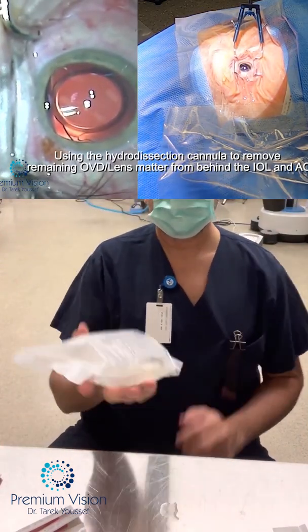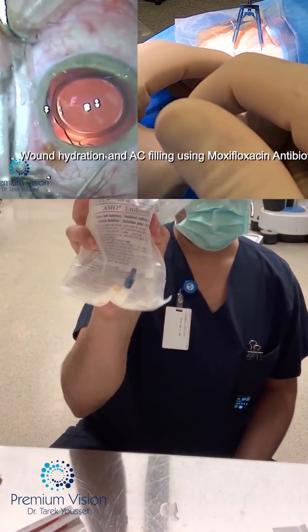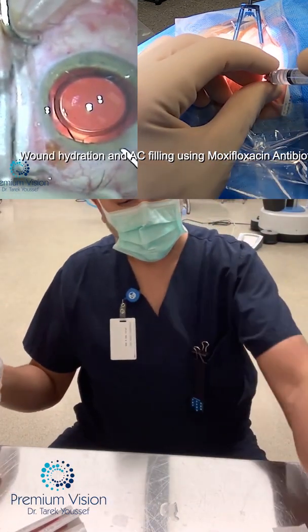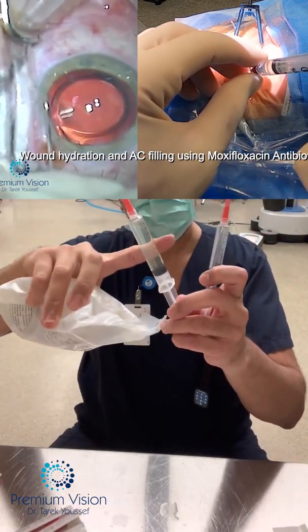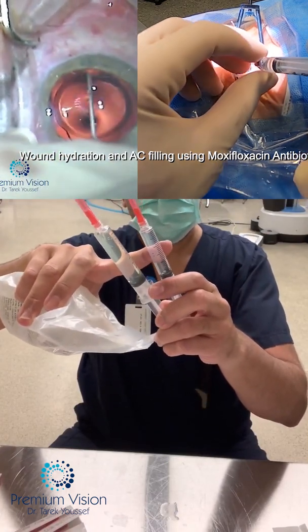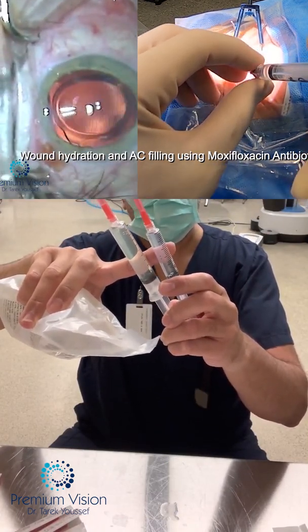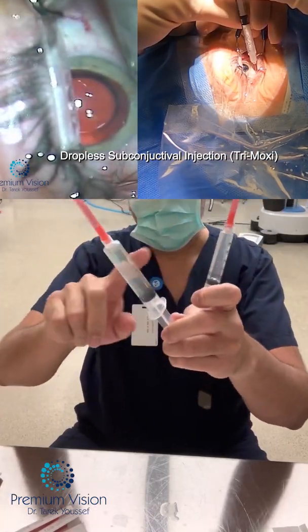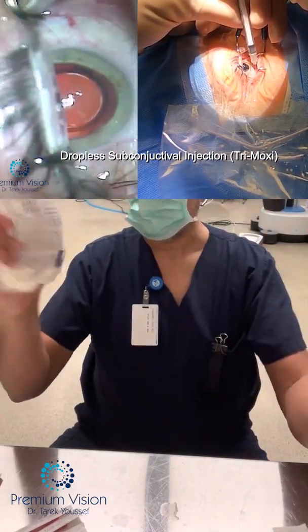So we have the xylocaine 1%. I don't put xylocaine or any additive into the endosol — it'll be standard use. The endosol is used as it is; I don't modify anything. I just do the addition at the end of the procedure for the antibiotic, and the phenyl-10 and the xylocaine 1% preservative-free. So this mix is for the beginning and that is for the end.